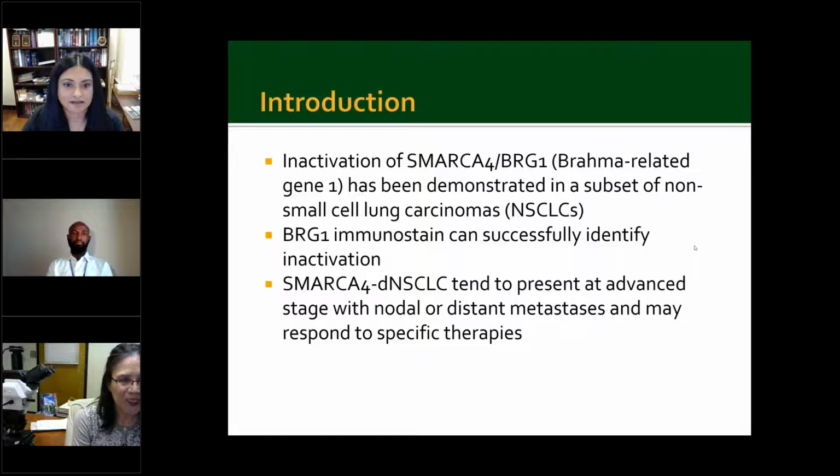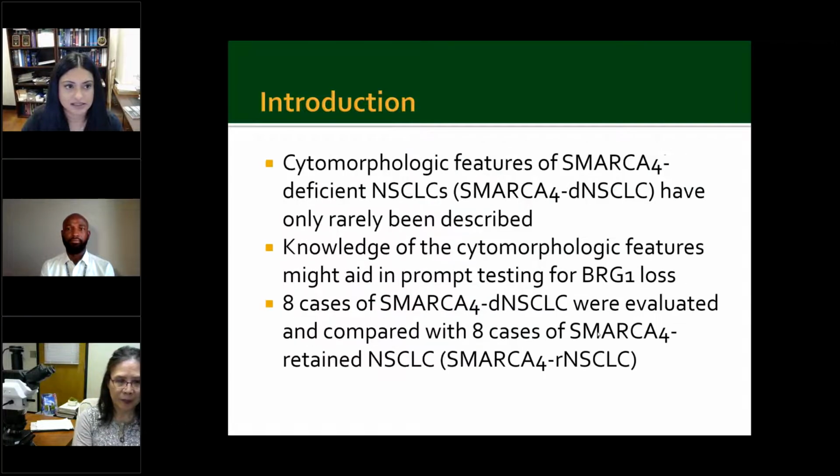Yeah, I love to hear those types of stories when I read articles, because it's always a certain case or a certain thing that sets you on this pathway to study these tumors. I love these types of studies that show you the cytomorphology for something that's been described in surgical pathology. I find them to be really helpful as a cytopathologist. So I'm really excited to be able to present some of your findings.